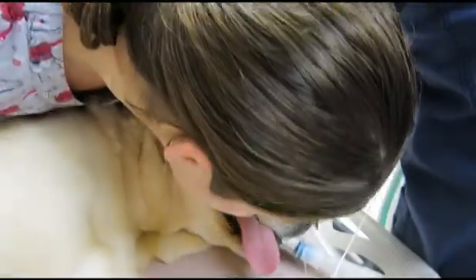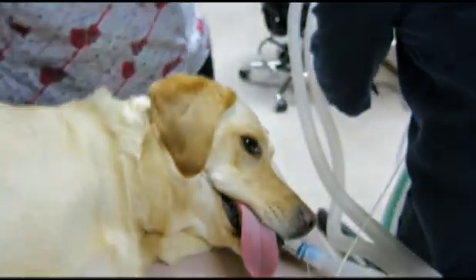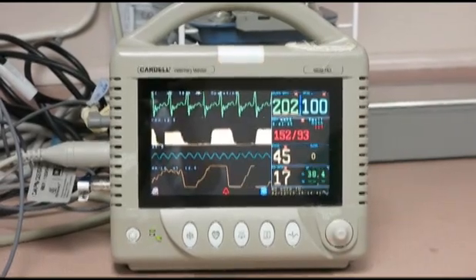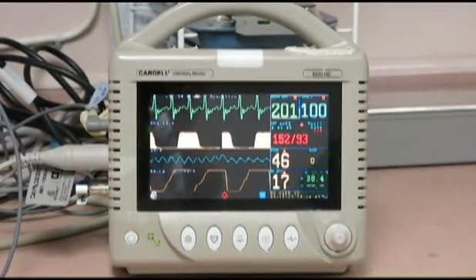My tech is checking for gas leakage and there isn't any. A monitor is also attached to our patient so that my tech can monitor her vital signs throughout the anaesthetic.